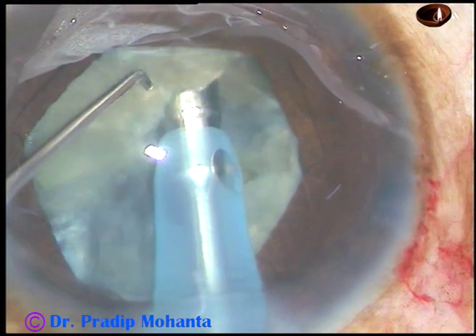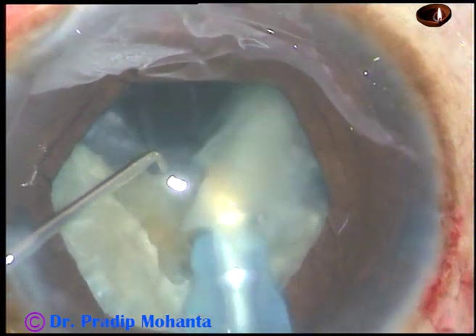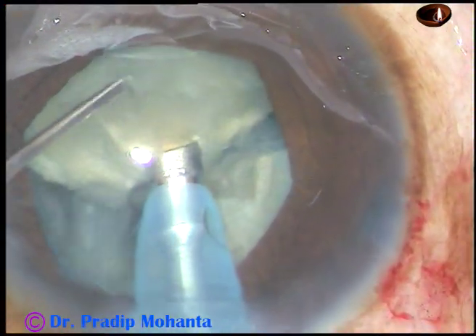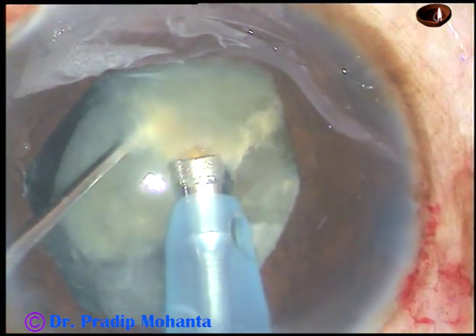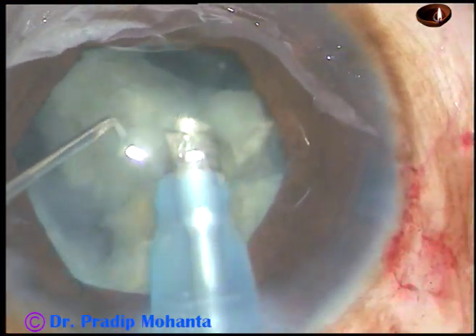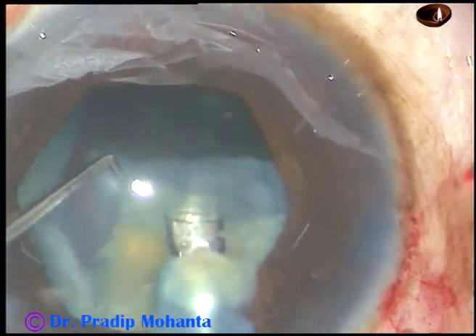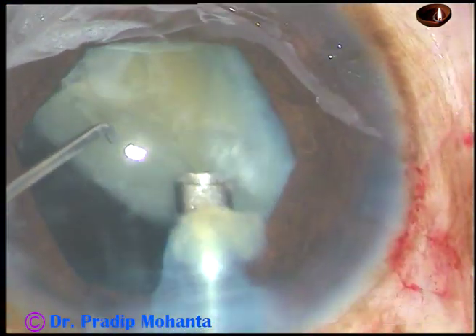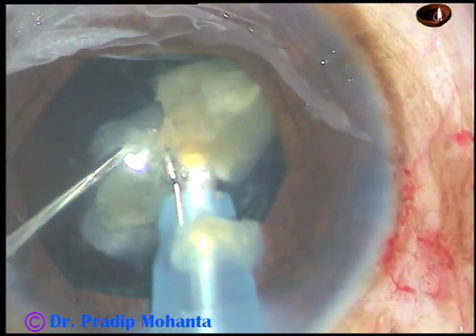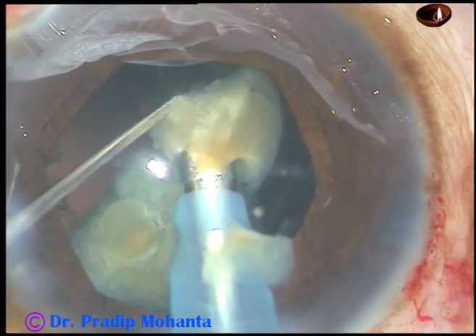Sometimes you can chop and as soon as the nuclear piece becomes free, emulsify it and then rotate the nucleus and chop again. In very hard cataracts, you can first chop all the fragments and then start emulsifying. This cataract is not very hard — it is grade 3 or grade 3 plus — so you can do either way: chop and emulsify, or chop all fragments and then emulsify.